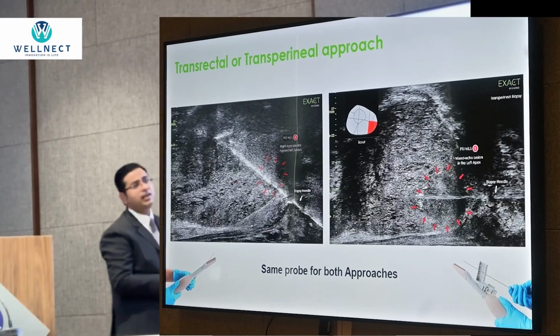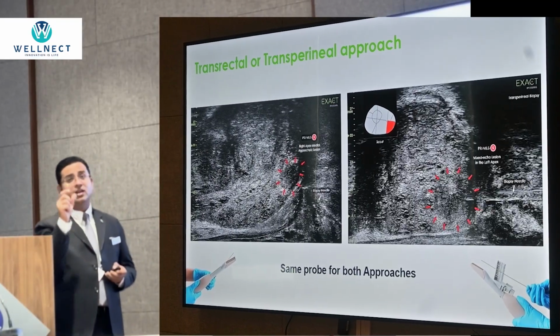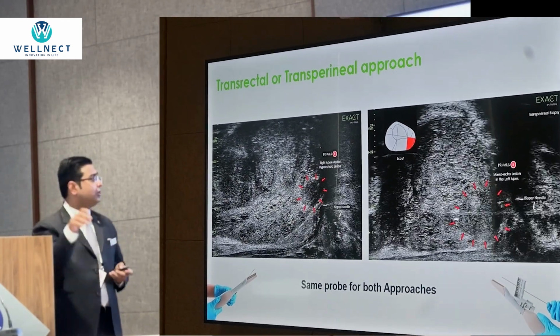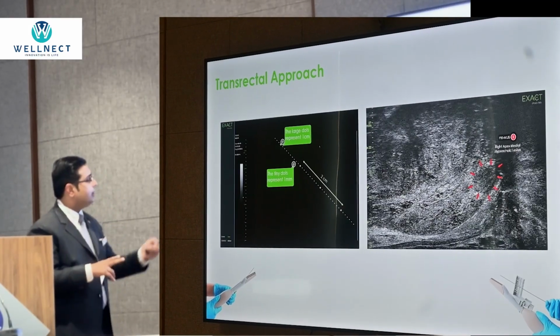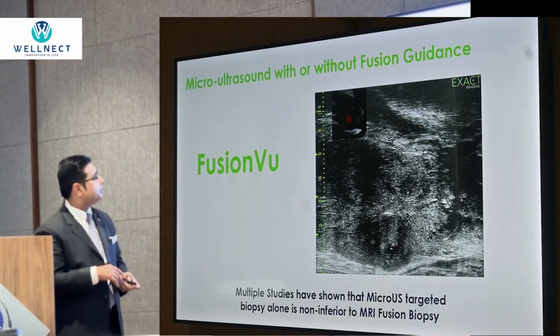One good thing is that it always gives you a measure in both the views. There are solid green dots that are separated by a centimeter, and there are smaller separations also. So it will give you how deep you are going in both the planes. That's how it gives you the separation, and then that will give you maps.